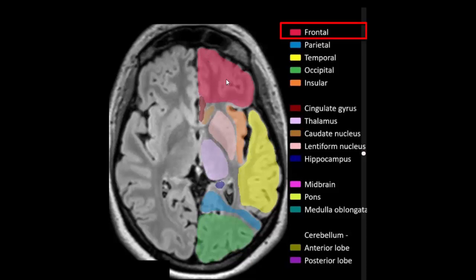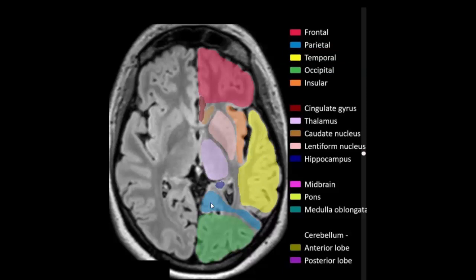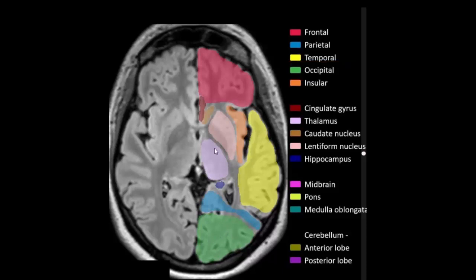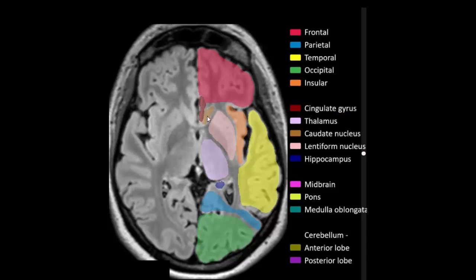Frontal lobe, temporal lobe, parietal lobe, occipital lobe, thalamus, lentiform nucleus, cingulate gyrus.